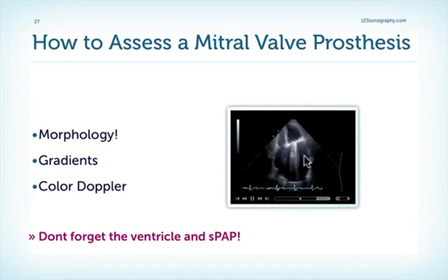Of course, we also look at the gradients and the color Doppler. How to perform and interpret Doppler information will be shown in the following demonstration. And finally, one other thing which I almost forgot to mention, don't forget the systolic pulmonary artery pressure, which is very important and is also an integral part of examining patients with prosthetic valves.